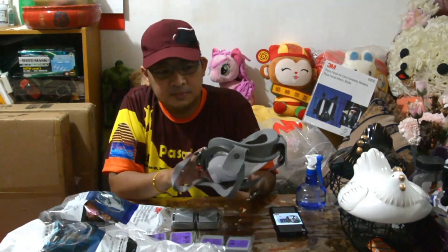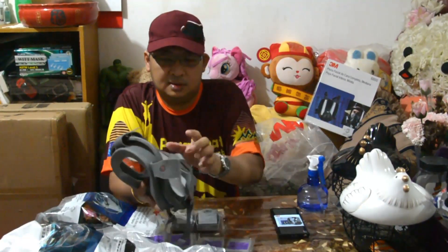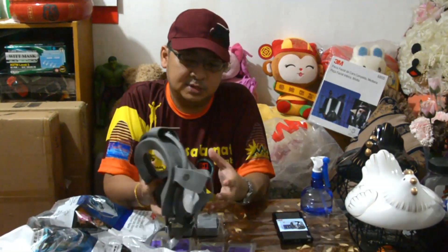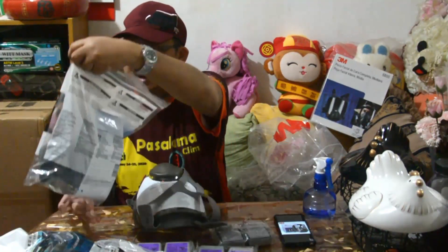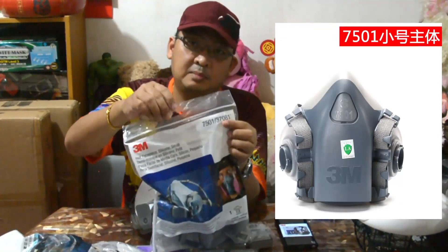Ito siya, pili siya ay daily use. Pero kailangan mo siya spray ng alcohol with tissue, may pa mo siya, itabi sa locker mo, sa opisina or sa hospital. Ito naman ay 7501 na mask.